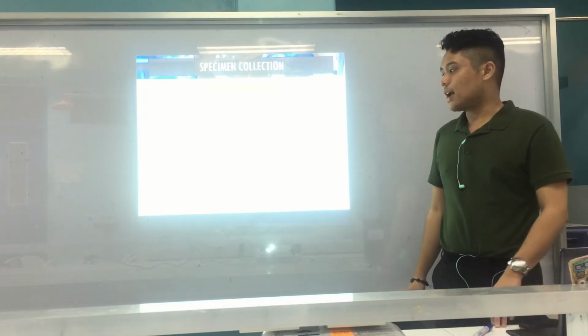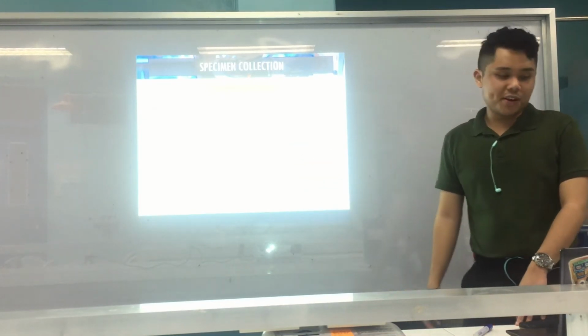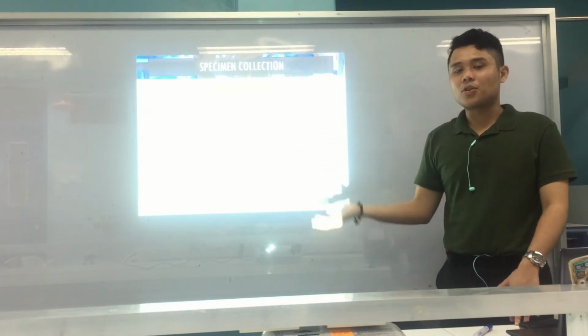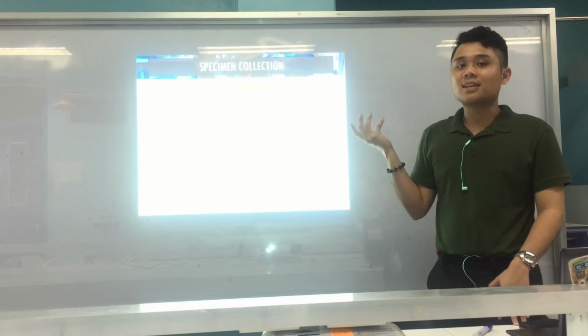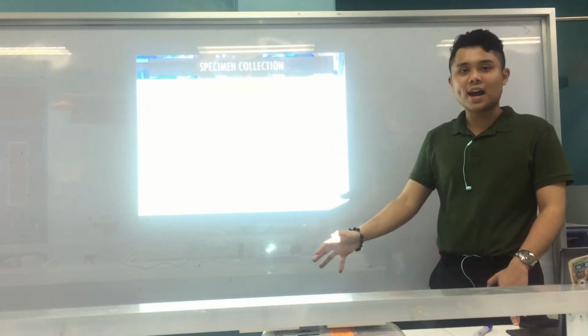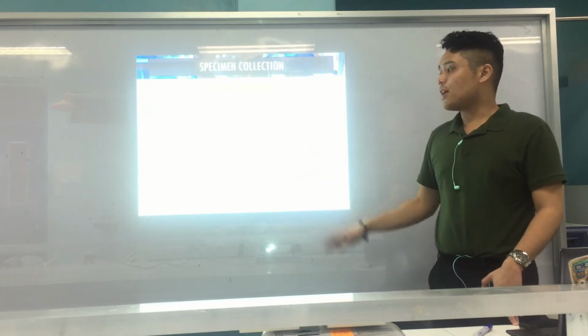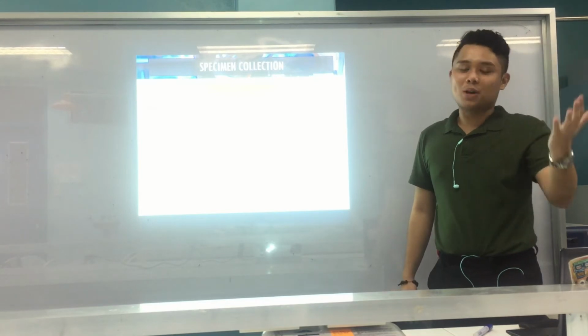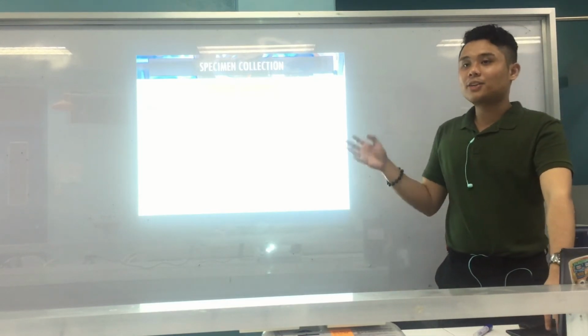Okay? Alright. And again, as mentioned, the sample must be free from contaminants such as urine, of course, because urine has its normal flora, or if the patient has another illness where urine is the specimen, it can introduce other microbes into the stool. Yeah? Barium and of course toilet paper. Alright. So of course, because again, these can introduce contaminants.